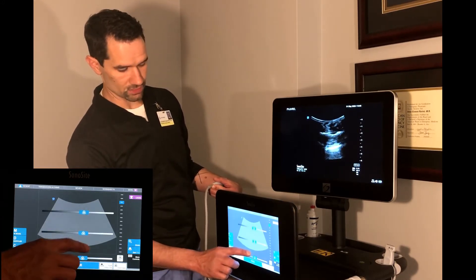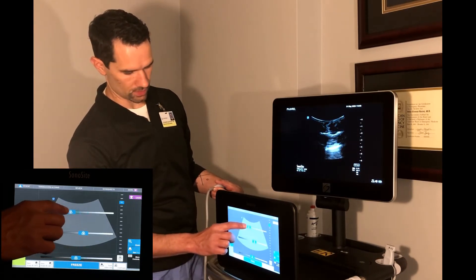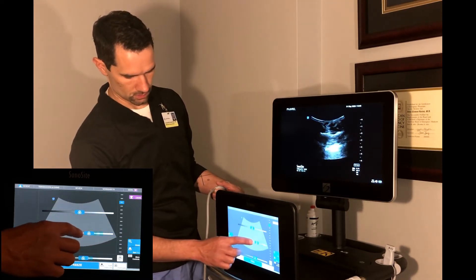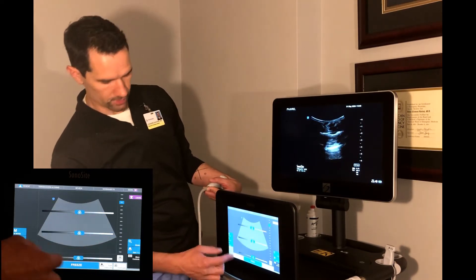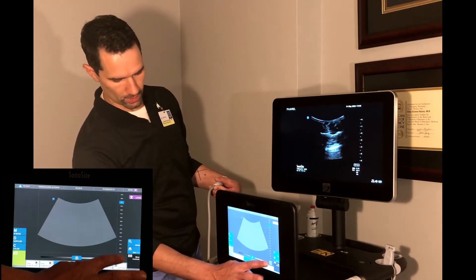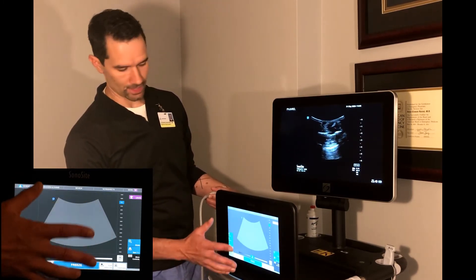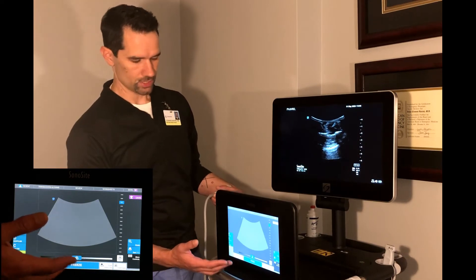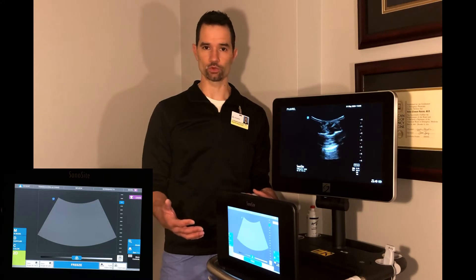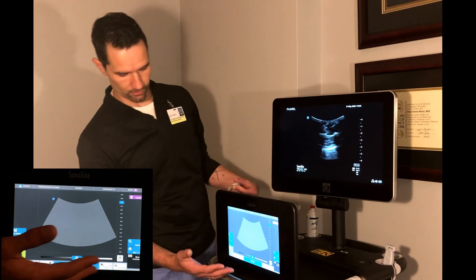If you want to adjust the individual gain of the near field and the far field, click on that control and adjust accordingly. If you want the machine to adjust the gain on its own, hit the auto gain key in the lower right-hand corner. The machine will interrogate the image and set the gain automatically, though it generally sets it for a darkened ultrasound room, so you may need to increase the gain slightly for the emergency room.